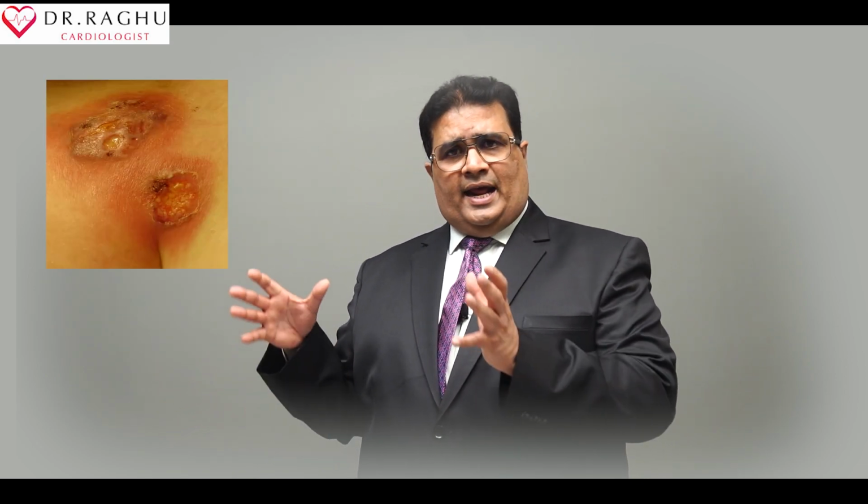The cardiac resynchronization therapy, despite being an excellent advance, like any surgical procedure, has a 1 to 2% risk of a procedure-related or device-related infection. So these infections are going to be a big nuisance and sometimes life-threatening. So all aseptic precautions should be employed, and the utmost diligence should be exercised by the treating team to achieve a zero infection rate. That's number one.